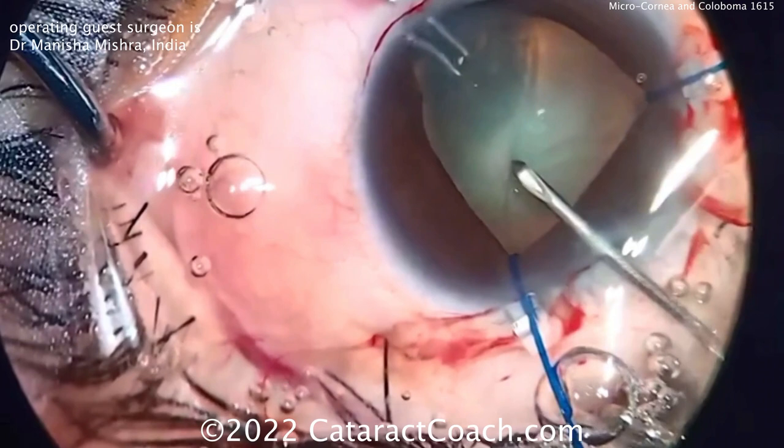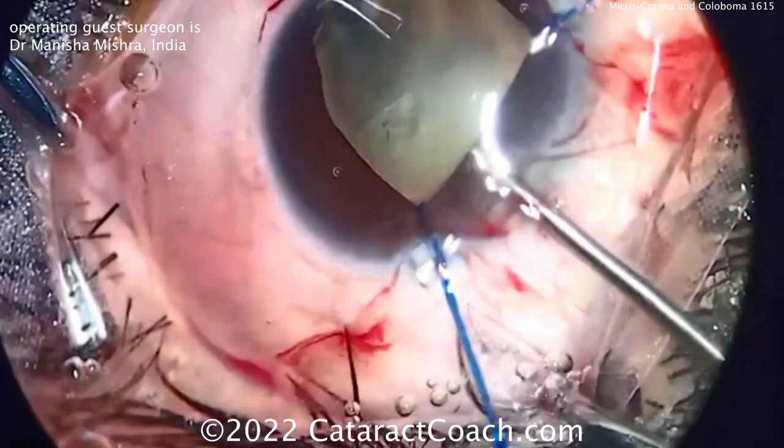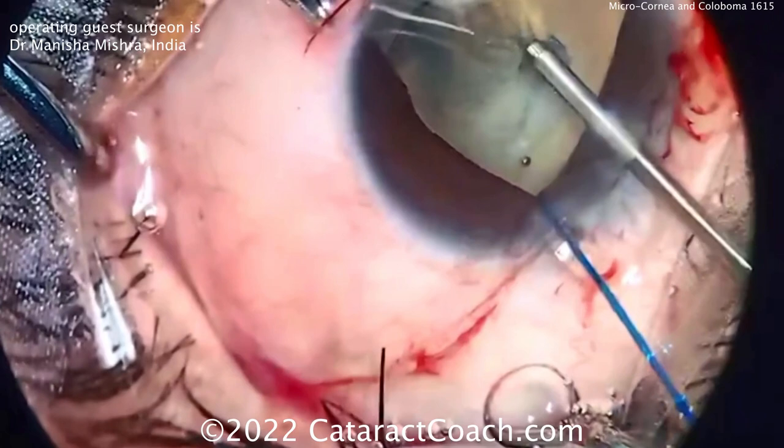You can see a little bit of wrinkling there with the lens capsule — a little bit of zonulopathy. Using a sharp system is helpful. Now getting more viscoelastic in, and using micro forceps — look at those, I like those forceps — and getting the rhexis completed.